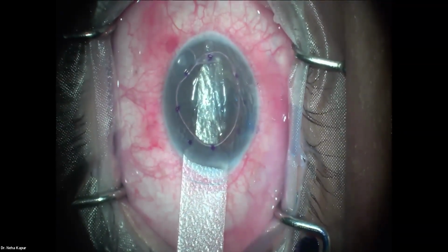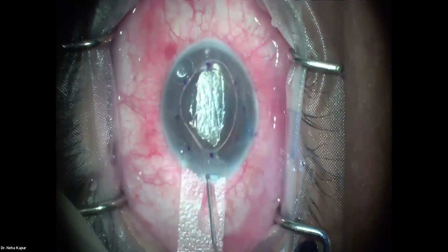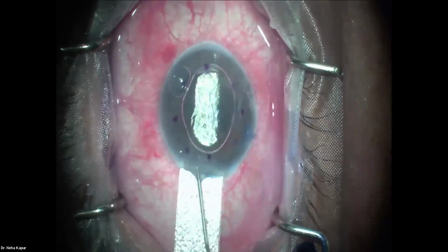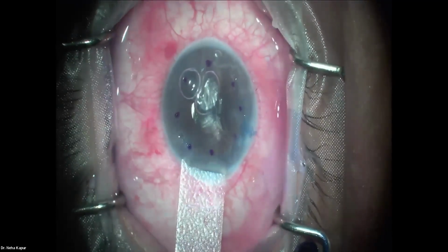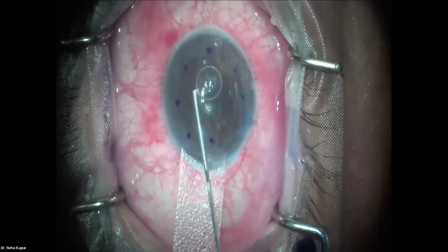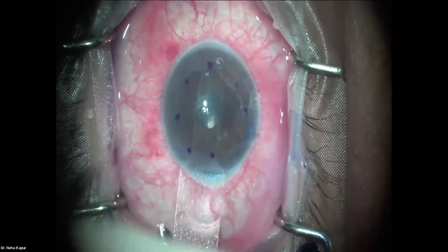Get all the air out from the eye, because like we said, we don't want any air in the eye. It's important to know, once you put the lenticule in, which plane our bubble is in. So it's always best to have the eye maintained in hydro and not air.